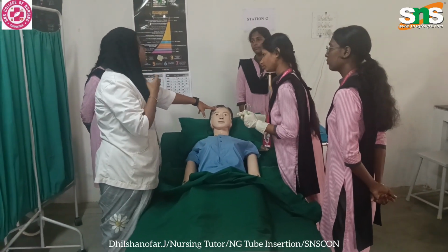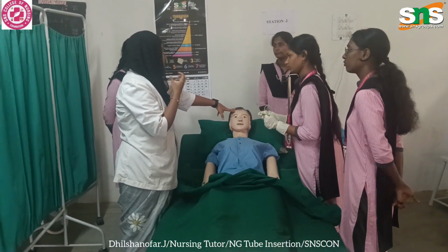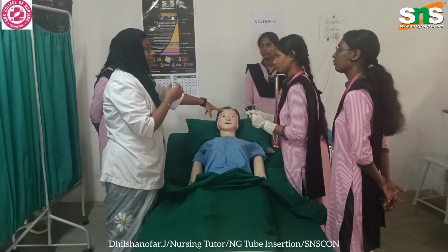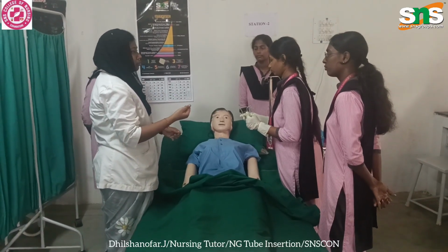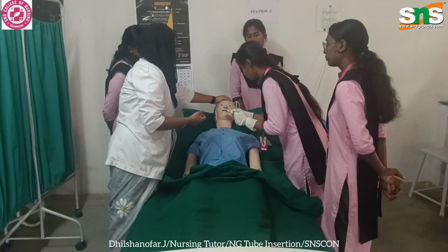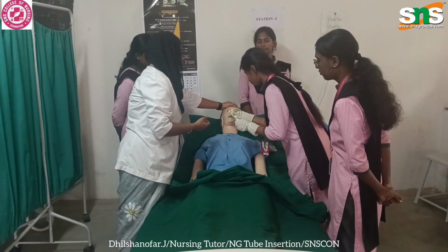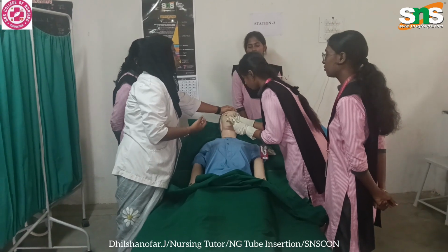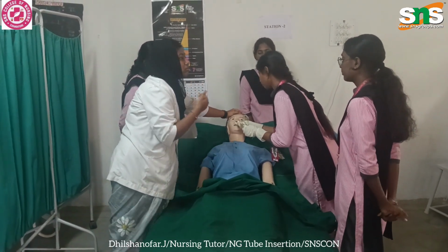Whenever you feel difficulty, you have to swallow. If you have coughing or an irritating sensation, you should say so, and at that time you have to stop the procedure and remove the tube. You have to ask the patient to breathe deeply and swallow.